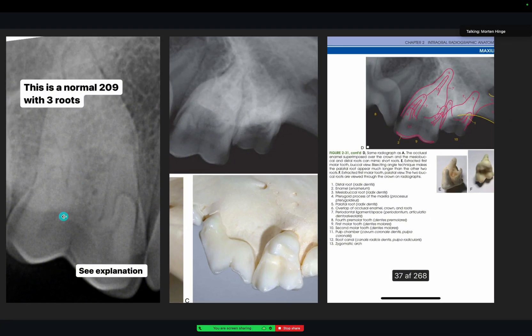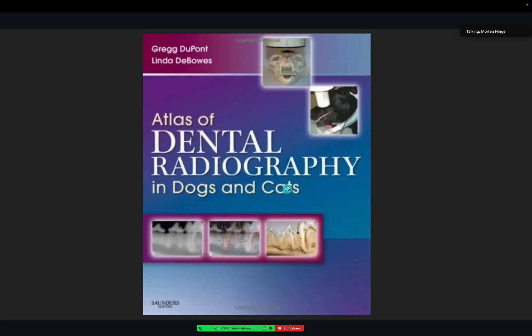Today I actually extracted one of the 109s and it had not three roots — it had four roots. That's why you should always do the post-op x-ray. Because I was sure I got everything out, I just took the x-ray because we have to, and there was one more root sitting right here at the furcation area. So always do the post-op x-rays. This is the book that these images are from — the 109 and the incisors and the bone images. It's a very nice book; you can get it on Amazon.